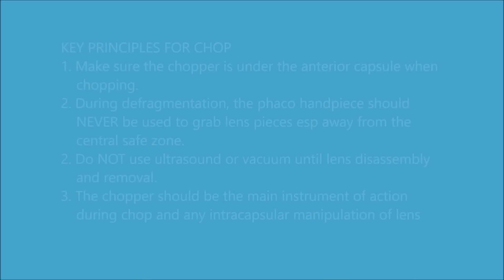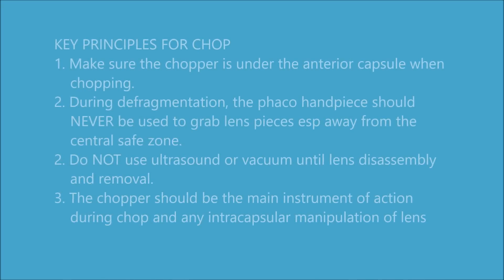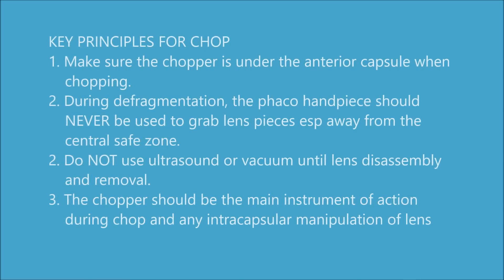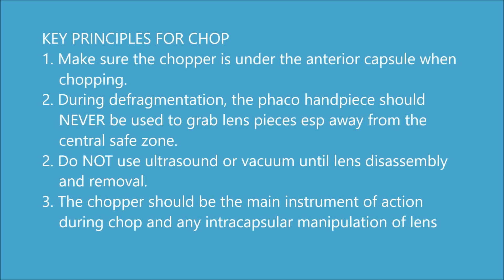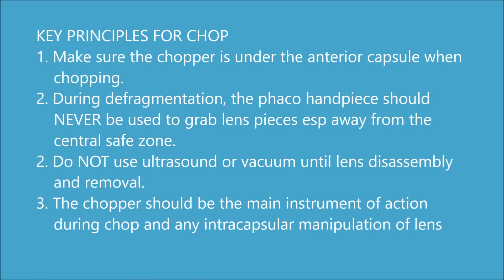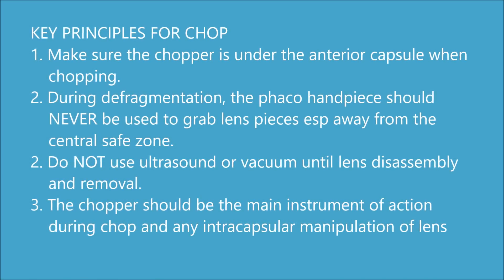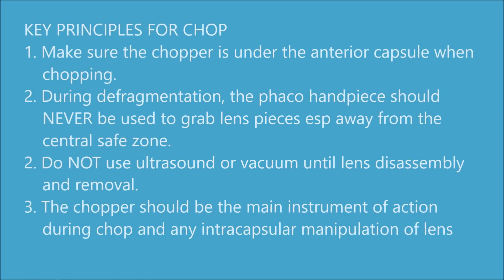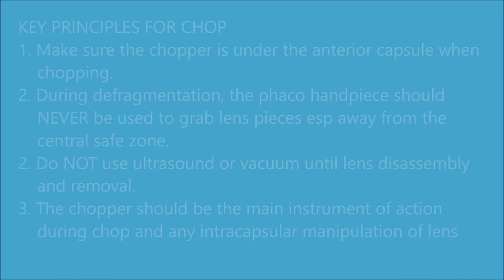During my technique, I do not apply any ultrasound energy or vacuum during the actual chop maneuvers, and because of this, this is safe in my opinion. Make sure the chopper is under the anterior capsule whenever you chop. During defragmentation, the Faco handpiece should never be used to grab any pieces, especially away from the central safe zone, otherwise you risk damaging the capsule or the iris. I never use ultrasound or vacuum unless I am ready to emulsify and remove the pieces. Make sure the chopper is the main instrument of action. I'll use the chopper to go out to the equator and the FacoTip is going to simply be counter force so that I can chop. I also use the chopper to manipulate epinucleus and grab fragments that are difficult to reach.